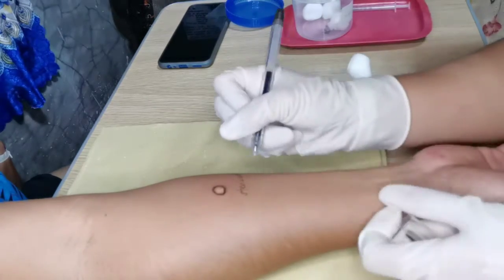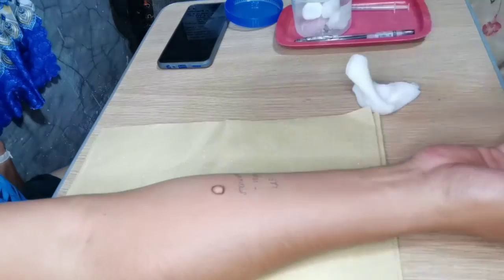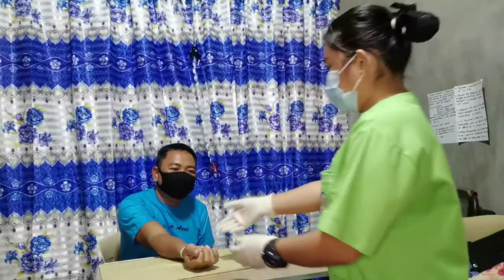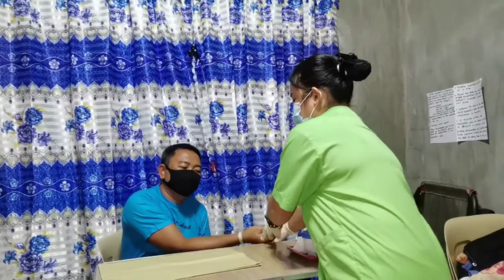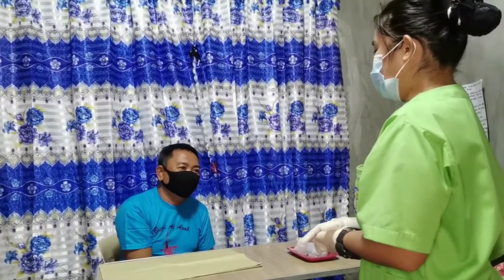Do not recap the used needle. Engage the safety shield or needle guard if present. Discard the needle and syringe in the appropriate receptacle. Assist the patient to a position of comfort. Remove gloves and dispose of them properly.